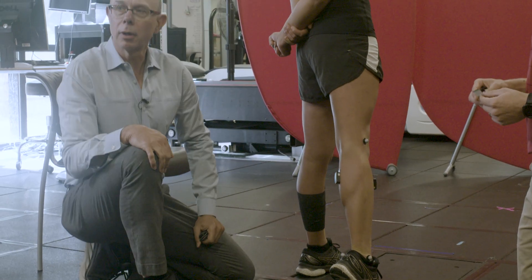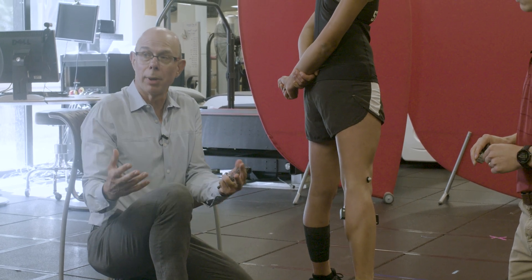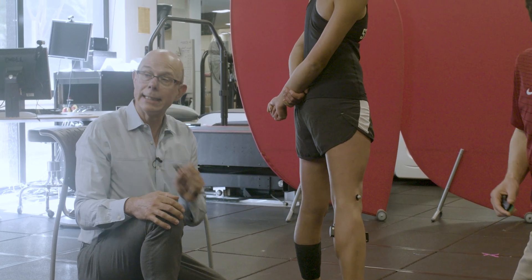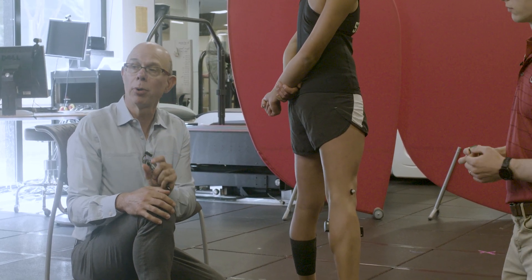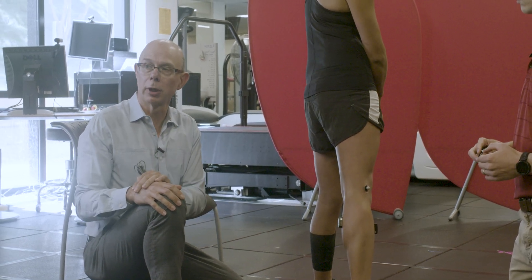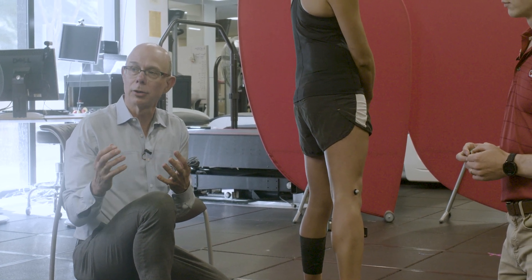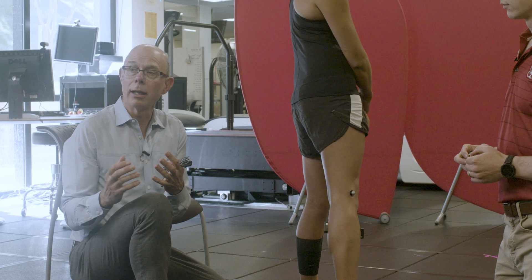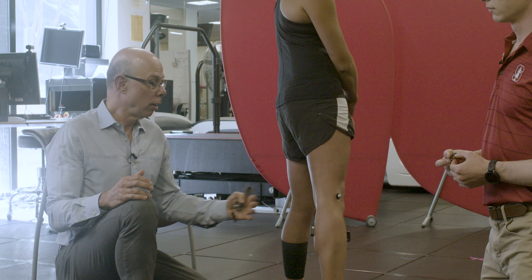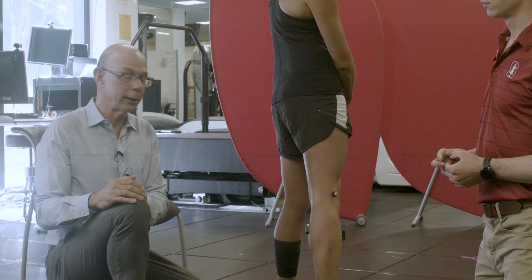It's kind of amazing — we place this electrode on a muscle that's excited by electrical signals, very small signals. This electrode detects those signals, a preamp amplifies the signal, and then it's transmitted wirelessly to a control system. So your nervous system is exciting the muscle, we can detect that microvolt-level activity, amplify it, transmit it, and see when muscles are active and how strongly they're active.